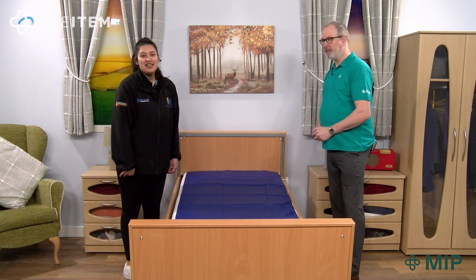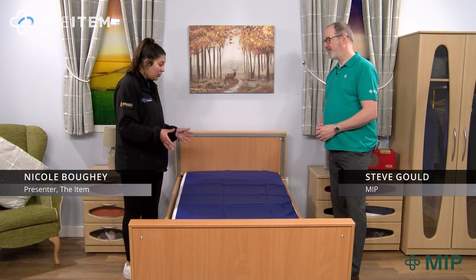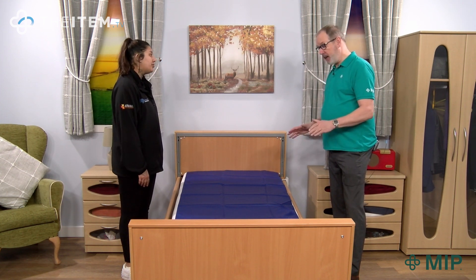Hi and welcome back. Today I'm joined with Steve from MIP. Steve, what have you brought with you today? This is the washable reusable flat slide sheet.